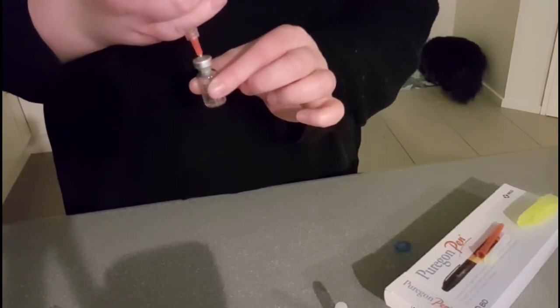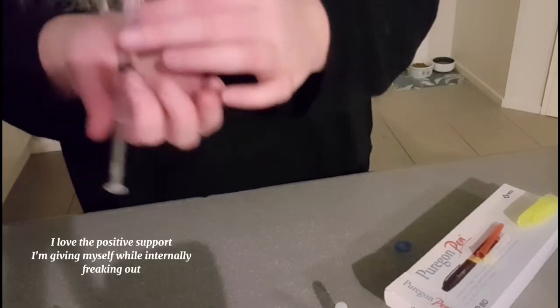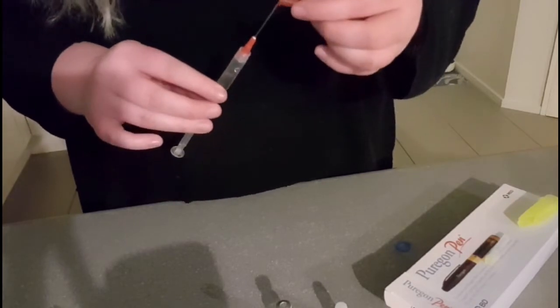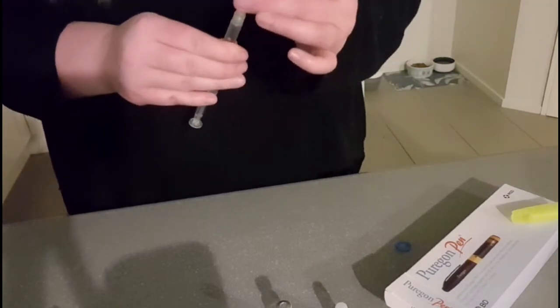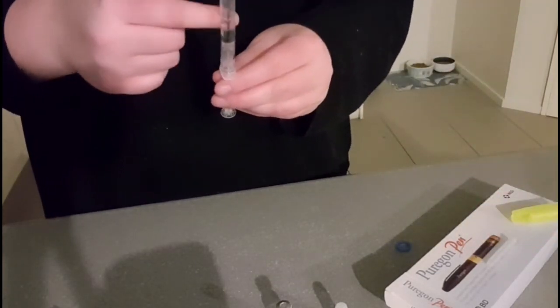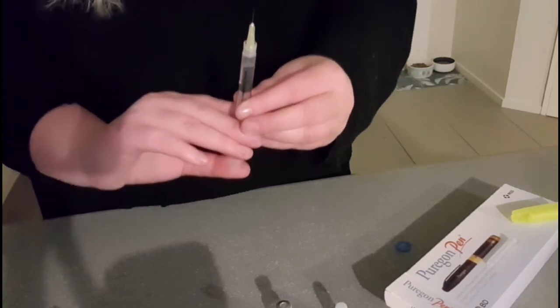We're getting a lot of air bubbles, so I'll get those out after — that's okay. Now we put this back on, put the liquid in there, take that off, put the shots in again, take the yellow one now. We're onto something. I do remember they said it's okay if there's a small air bubble in there, but obviously I've got a huge one.